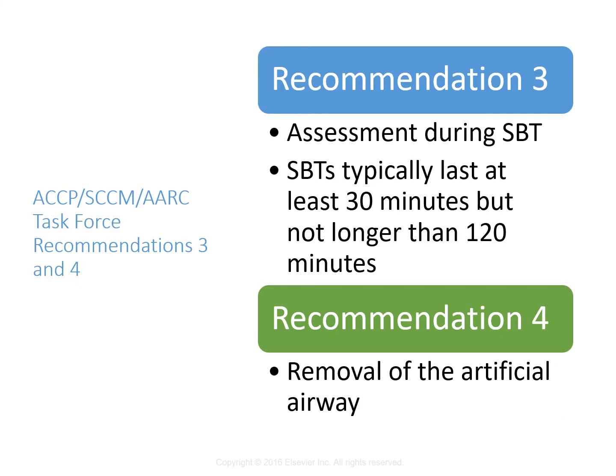Recommendation number 3, look at them during the spontaneous breathing trial. So when you're looking at discontinuation assessments, you should be doing them during spontaneous breathing rather than while they're on a lot of vent support. So when we do the spontaneous breathing trial, this is where we're looking at how they're doing, right? You're not just looking at them during full support, you're looking at them during the wean. And then you're looking at that to determine their tolerance of the trial.